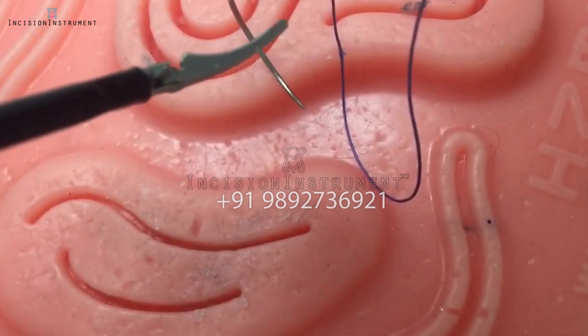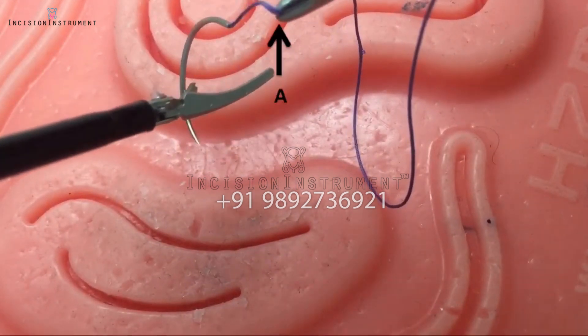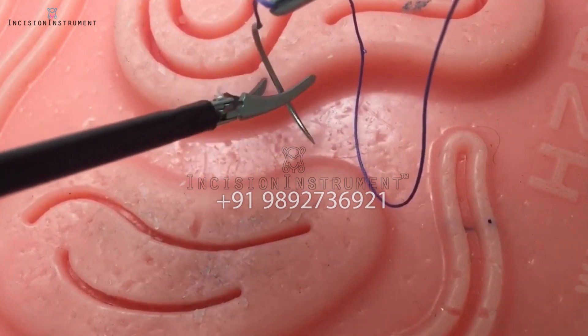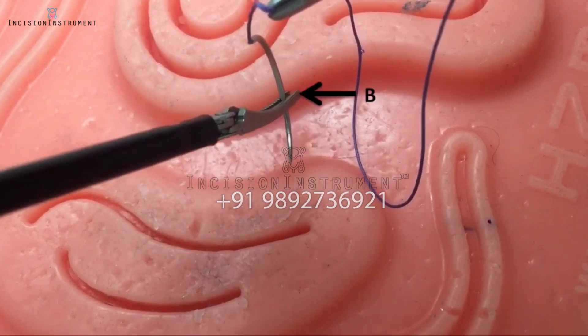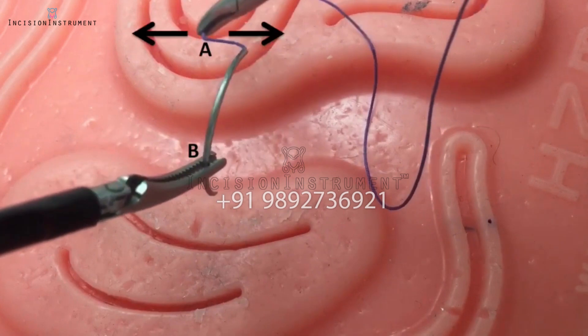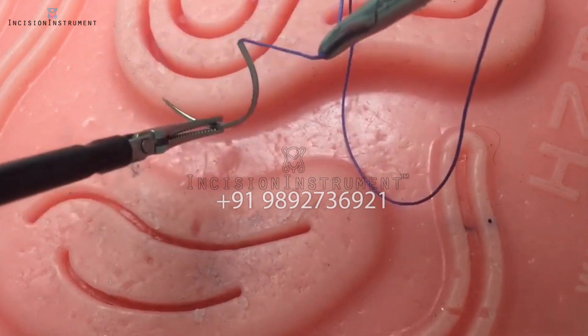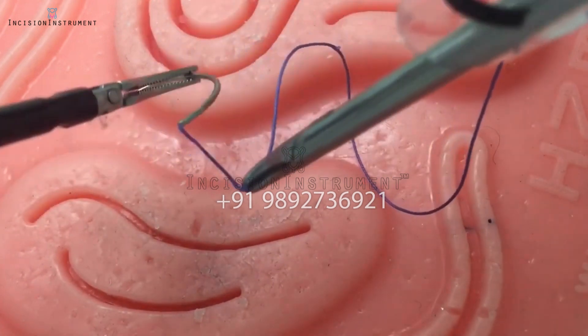Needle handling. Once the needle is within the box trainer, maintain the right grasper at point A and loosely grasp the needle with your left instrument at point B. While stabilizing your left instrument with your right instrument, gently move in a to-and-fro manner to swivel the needle. With practice, you will be able to move the needle in every direction freely.